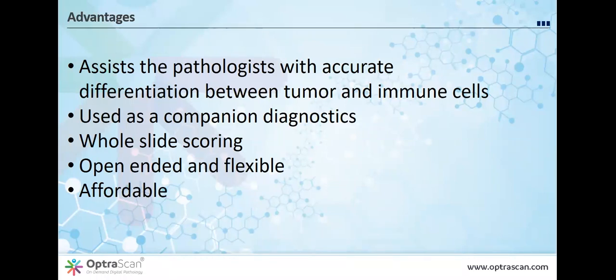It's in some ways very humbling to go back and look at morphology. And you know, I've been doing immunohistochemistry for many years. I mean, our lab in Oxford was the first to do it, and the first thing I learned from it was, in fact, how poor, now poor is not the right word, how imperfect my morphology was in terms of cell identification.